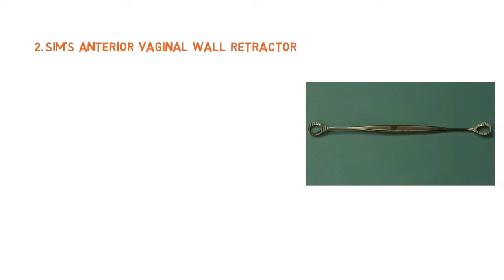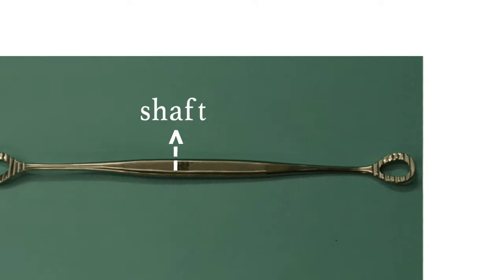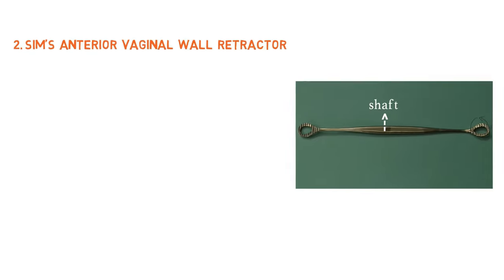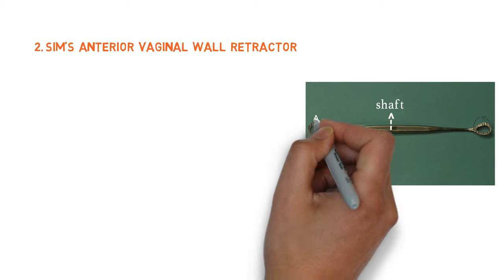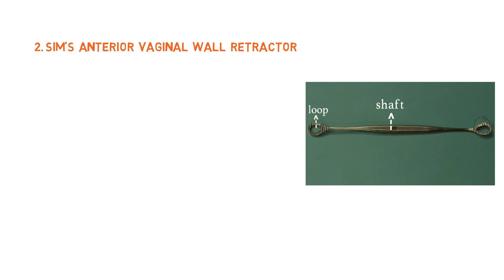Our next instrument is the Sims' anterior vaginal wall retractor. You can see it is a long metallic instrument with a slightly angulated fenestrated end and a central handle, which is also known as the shaft. You can see these are the serrations or fenestrated ends, and their significance is to fit into the rugosities of the vagina to give a better grip.